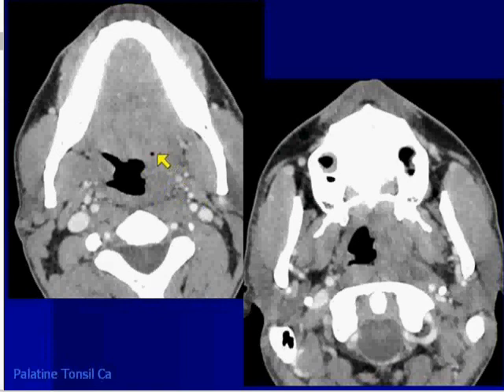This is a patient with a left palatine tonsil squamous cell carcinoma. Notice here's the internal carotid and prevertebral musculature. They have a cystic nodal metastasis. Patients with squamous cell carcinoma of Waldeyer's Ring can have cystic nodal metastases — more commonly seen with tonsil cancers, base of tongue, and sometimes nasopharyngeal carcinomas.